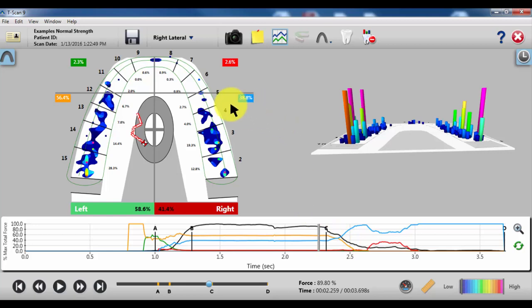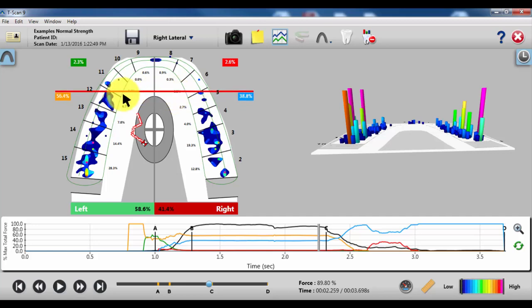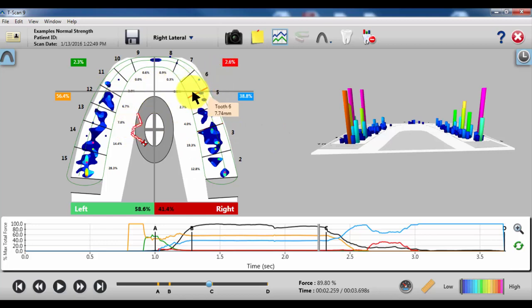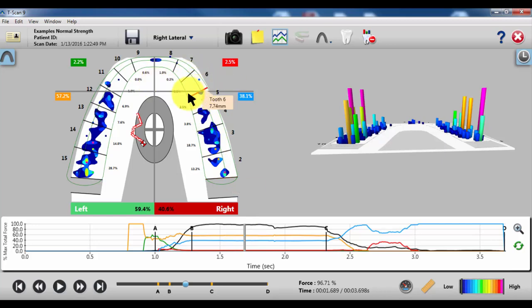What we look for is we want to define the excursion. The first thing you really need to do is make sure this bar is behind all canine contacts. You can see that this is the right lateral. I want to focus on tooth 6 to make sure this bar is behind the contacts on 6. You can see there's really no contact on 6, but it's back there.